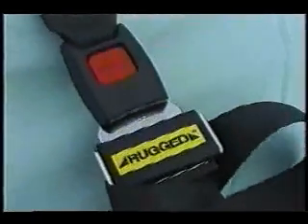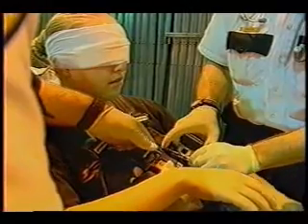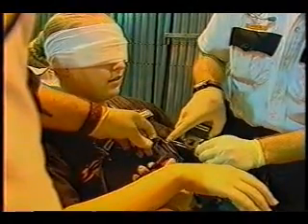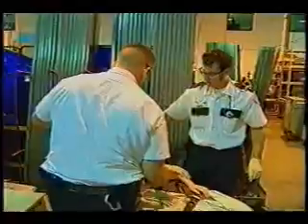The Easy Pro safety restraints are easy to attach and secure across the shoulders and chest, and leg straps can be secured at several places along the frame in order to fit the patient. Even though you can transport or load the cot without the side rails raised if the safety restraints are secured, I keep them up. That's just a good secondary restraint.